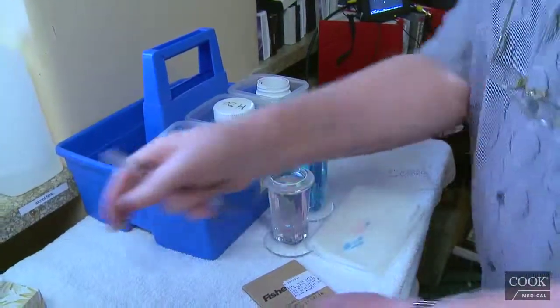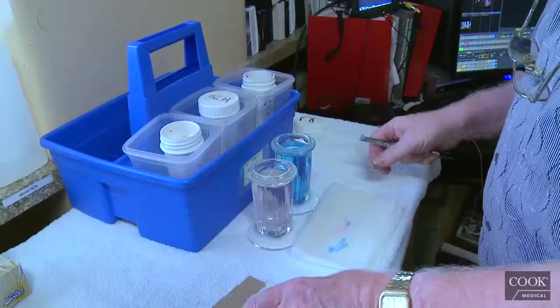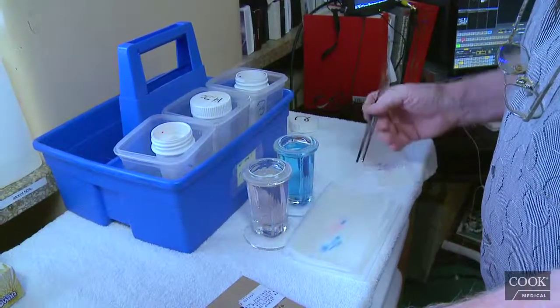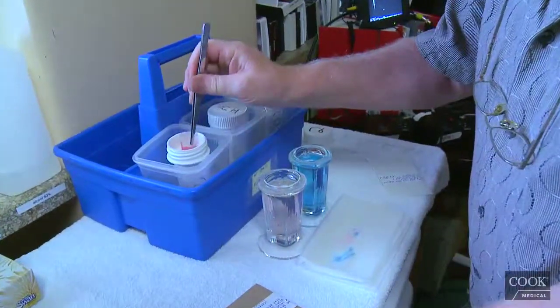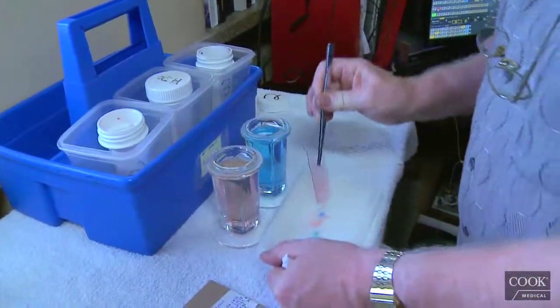So again, what we do now is we use the Diff Quick Stain, which is a very fast staining procedure. Takes less than 30 seconds. So 15 seconds in each of the staining solution.